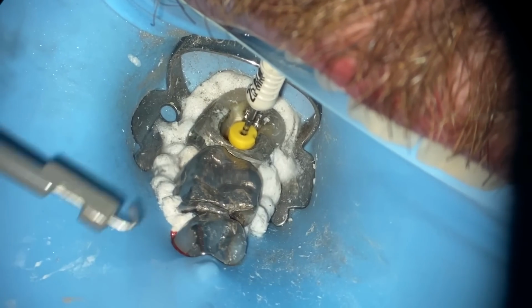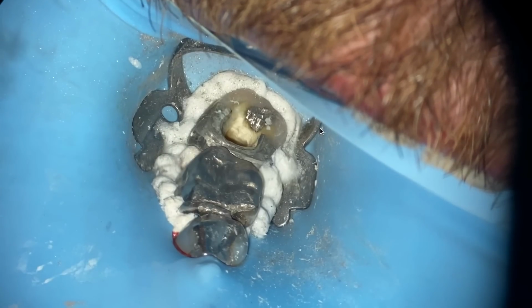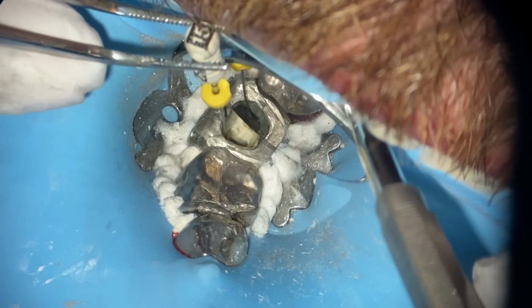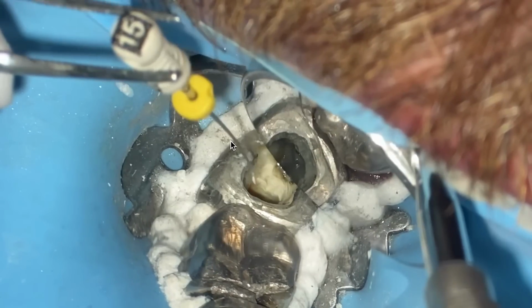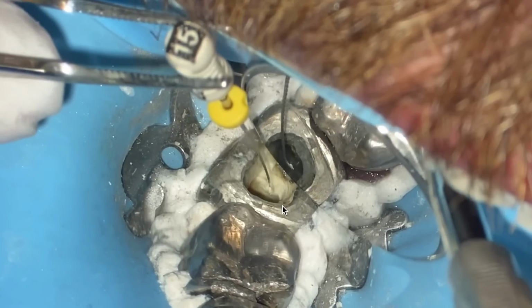And that's it. So that is another way, because what happens is, I'm sorry, I'm going backwards here. When you use your fingers, you can't put your mirror in; there's no mirror in the way. You kind of have to do it with a bend in the file, and you have to have really straight line access in those canals. So what you can do is use your cotton forceps to put a bend on your file. See, there's a subtle bend, and the bend is actually intended for me to get into the mesial part of the tooth.